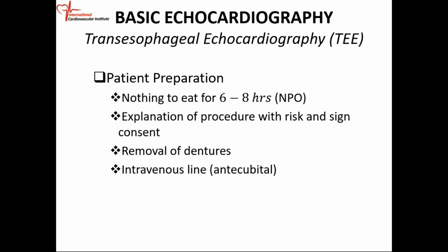Make sure you have an intravenous line, especially in the antecubital area. If you're going to do saline contrast studies, you need a large bore IV line in the antecubital area. Don't send the patient to the procedure room with a line in the hand and expect to do a contrast study.